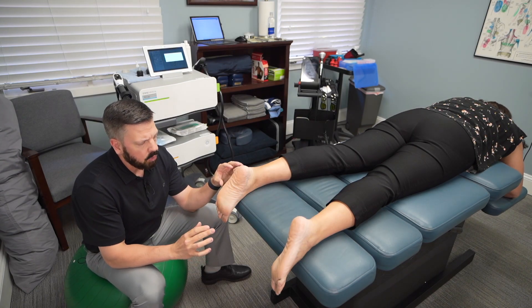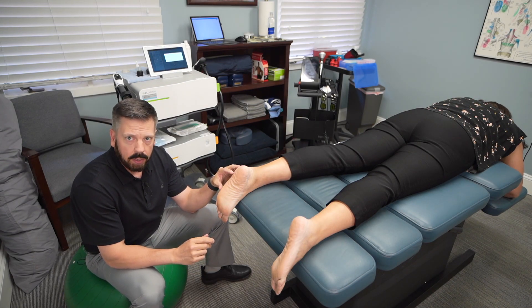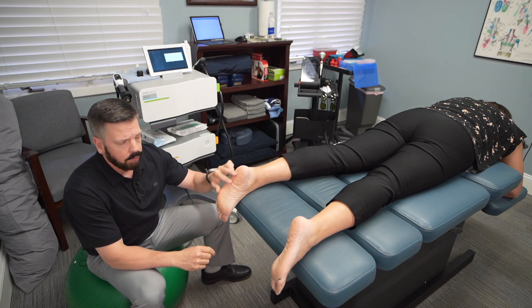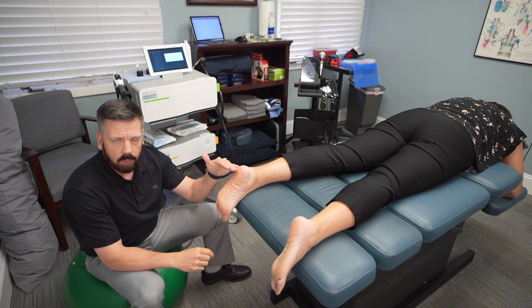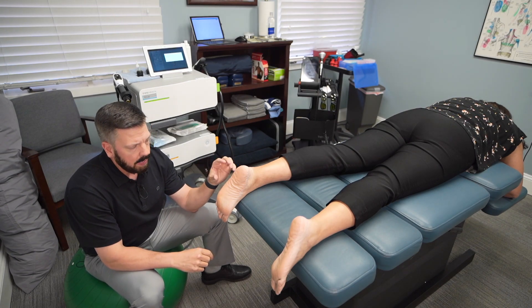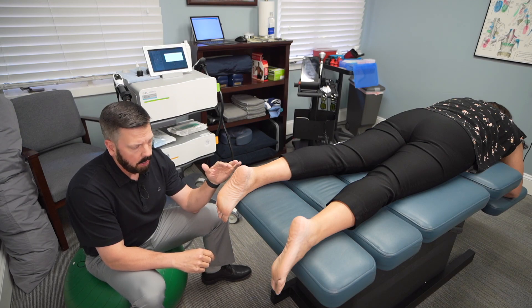Focus shockwave is the main treatment we use for plantar fasciitis. We also support the treatment with active release technique and Graston technique, which is a scraping technique — those work as well, but the main treatment is focus shockwave to help break up that scar tissue or those adhesions located deep in the plantar fascia.